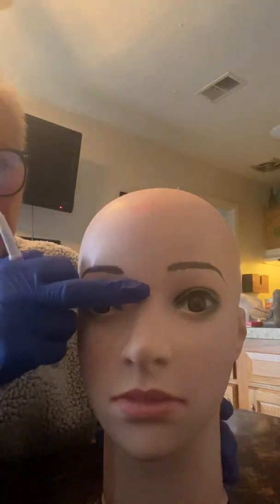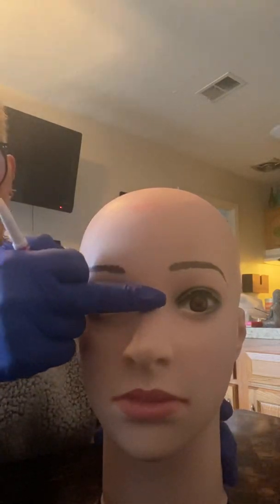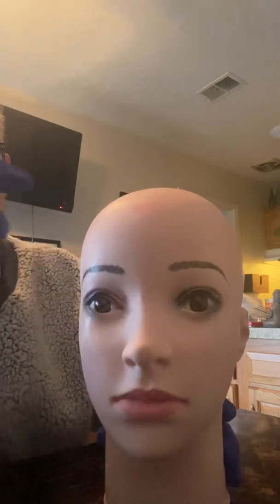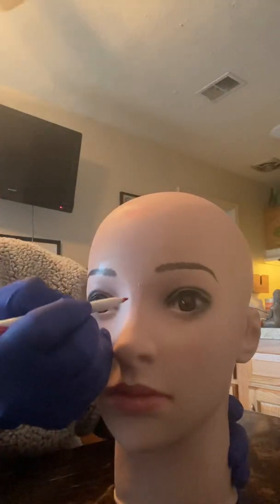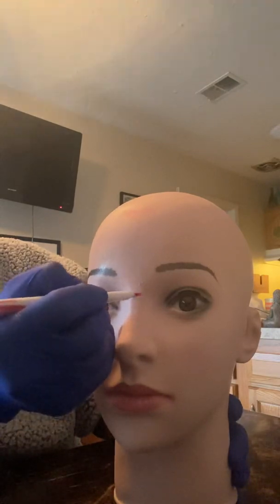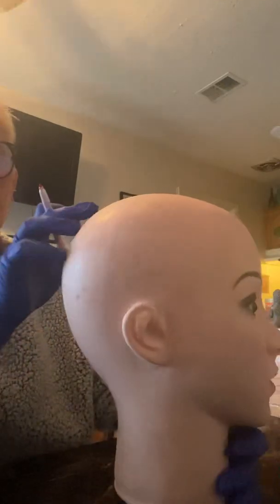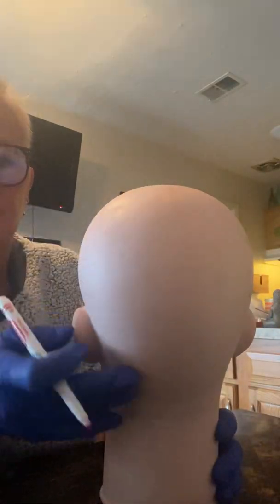The first one is going to be the nasion, which is right here at the bridge of the nose where it meets the forehead. I'm just going to make that mark right here for the nasion, and the second one is going to be the inion.